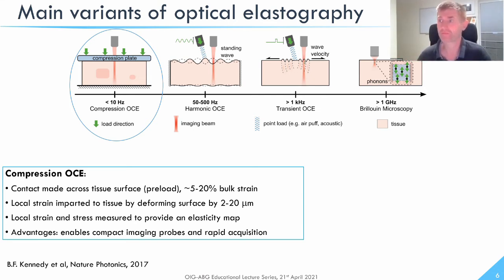When you've got these wave-based approaches, which are very elegant and work quite well, the problem is that you need to detect the propagation off the axis of the optical beam. The advantage of some of these wave-based approaches, however, is that you can do a non-contact approach. So a lot of colleagues in the field are looking at applications in the cornea, for example, where you don't want to physically make contact. So these techniques are suited there. So really, it's a case of choosing the best technique for the application that you have in mind.